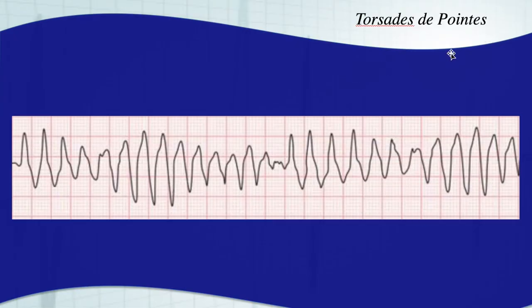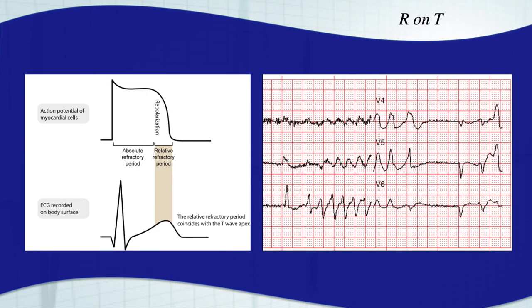It's torsades. Torsades de pointes — turning of the points — that bow tie configuration. It's hard to discern the bow tie configuration on a 12-lead; it's much easier on a long lead. It's also hard to catch because it's typically a transient rhythm — it comes and goes almost always. It's paroxysmal in nature. So we're going to talk about torsades a little bit deeper and why it's important to be able to discern torsades versus a normal QT or non-prolonged QT polymorphic VTAC, which is completely different.